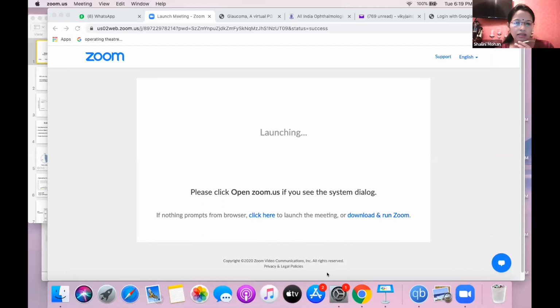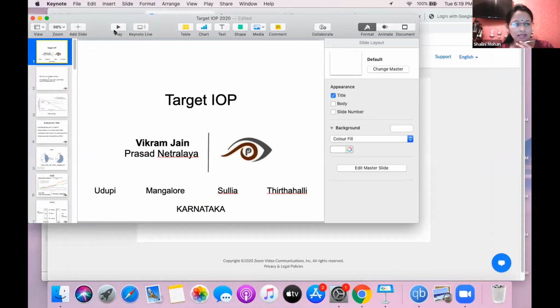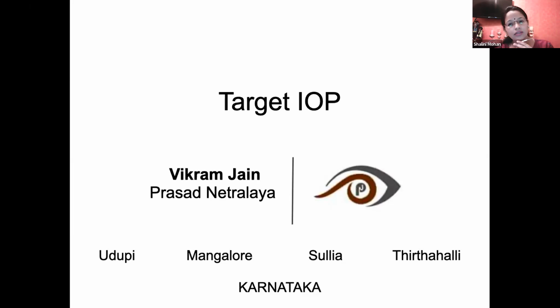One more question: what is the best type of tonometer for post-penetrating keratoplasty patients? Yeah, as I discussed, the Mackay type of tonometers are best for keratoplasty patients. The one commonly available to us is the TonoPen. In fact, the rebound tonometer is also reliable in that case. You can use either of the two because the area touched by the rebound is also very small, and the TonoPen is obviously based on the Mackay type of tonometer. So either of the two can be easily used for keratoplasty patients.